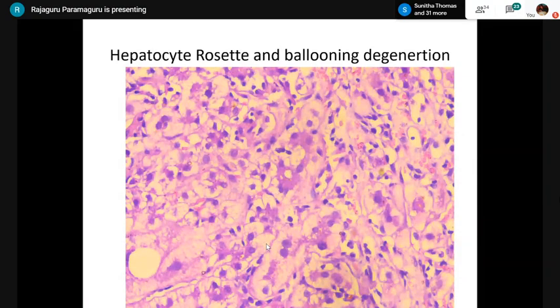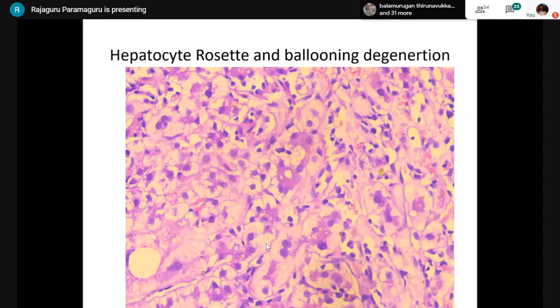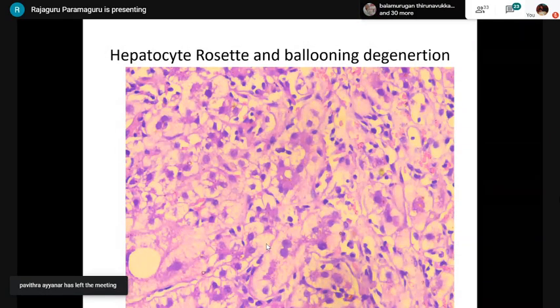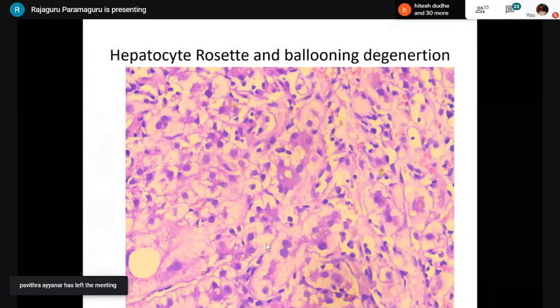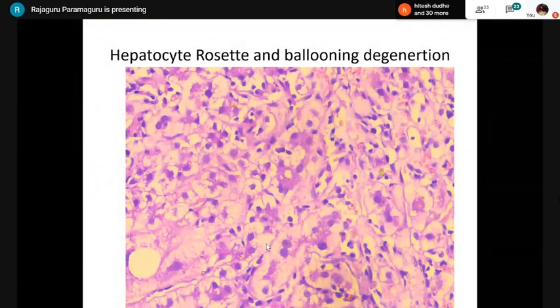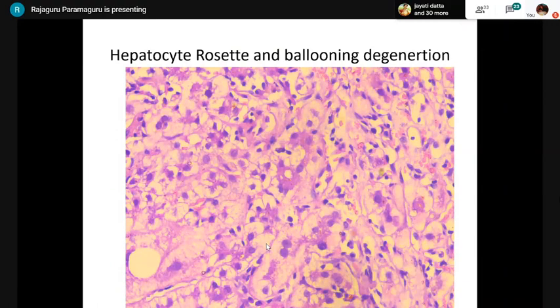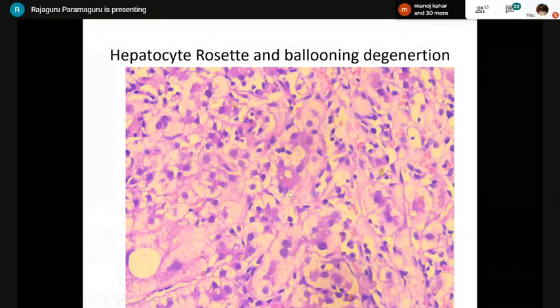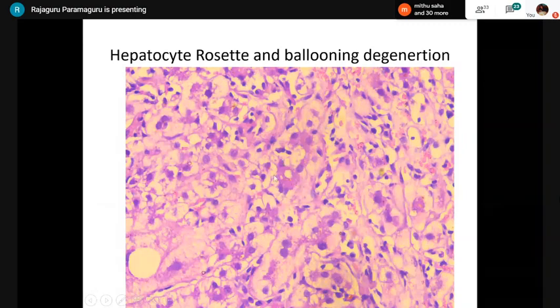Hepatocellular rosettes: the linear single cord arrangement of hepatocytes is lost due to acute hepatitis or regenerative activity, and cells form a rounded gland-like structure with or without a central lumen.